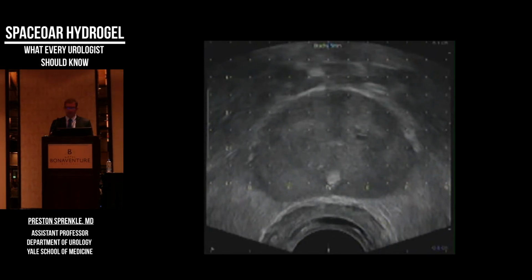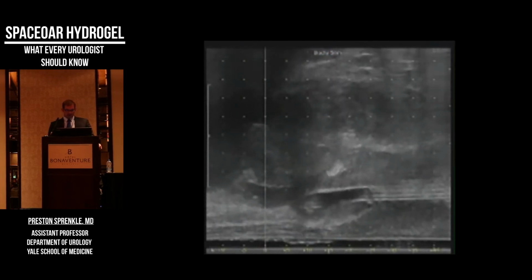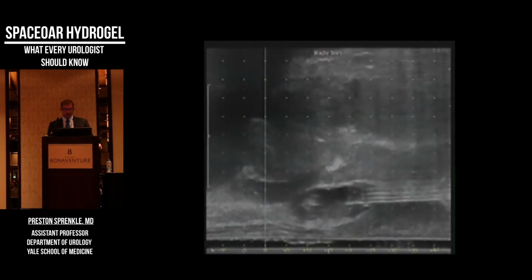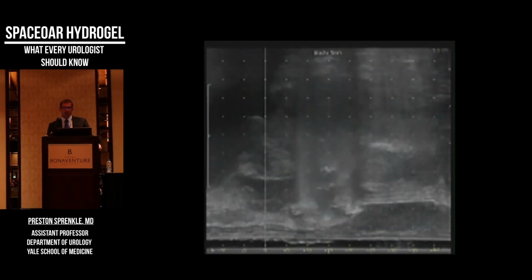Still there? Okay. So a quick video of an ultrasound procedure. Looking in the axial plane, you can see the rectum, which is down here at the very bottom, is close to the prostate. It's about 3 millimeters. I don't know what the real measurement is. Here it's a little more difficult to see, but the prostate is here, the rectum is down here, and here's the perirectal fat. We don't really see the rectum other than over here on the right side a little bit. This is the injection of saline to elevate and develop that space posterior to the prostate, anterior to the rectum.